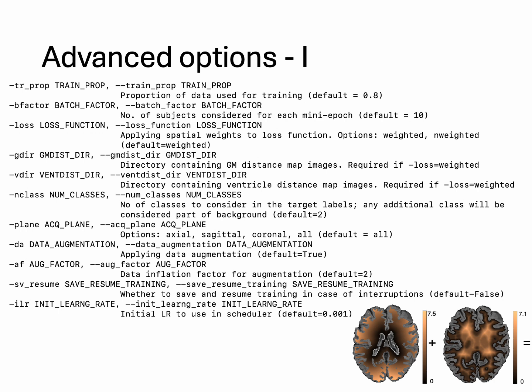So in those cases, if memory is not an issue, it would take anywhere between 30 to 100 GB, depending on the model size and the data that you use. So I would recommend switching it on if you are running it on a shared resource. And then initial learning rate, right?